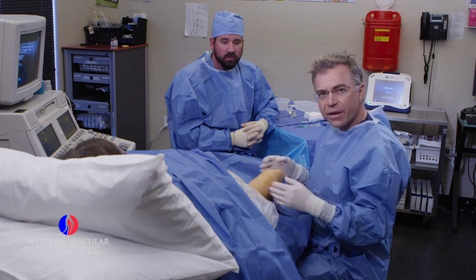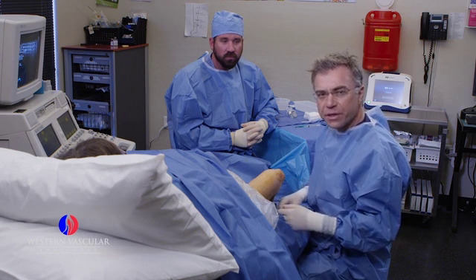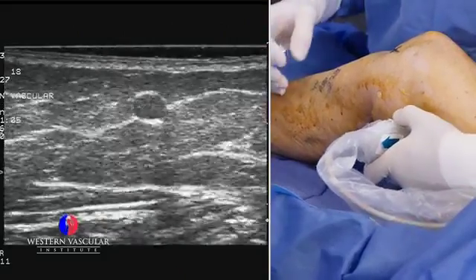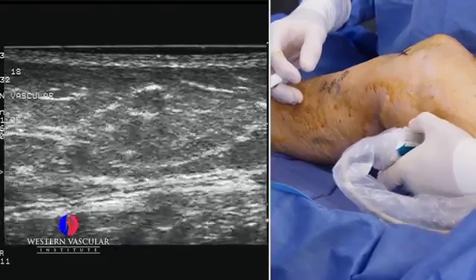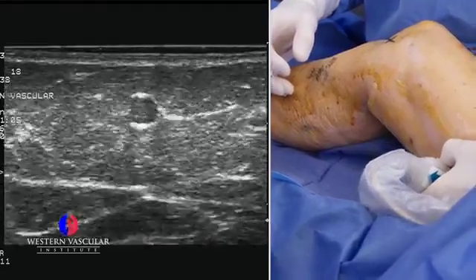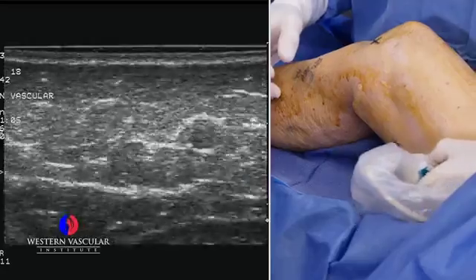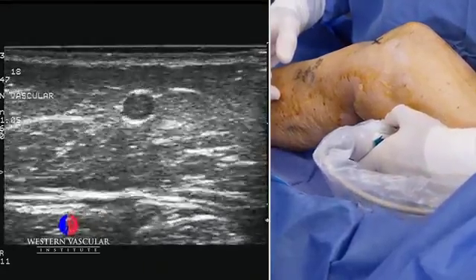We're going to shut down that vein with what's called a closure fast procedure, or radiofrequency ablation. What we see here is a dilated greater saphenous vein — I'm compressing that with the ultrasound. Within this whole vein are incompetent valves. You're not going to be able to see the valves with this view on the ultrasound, but it is an abnormally dilated vein which is incompetent.